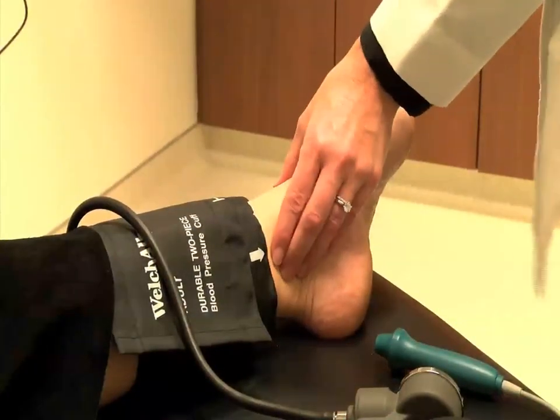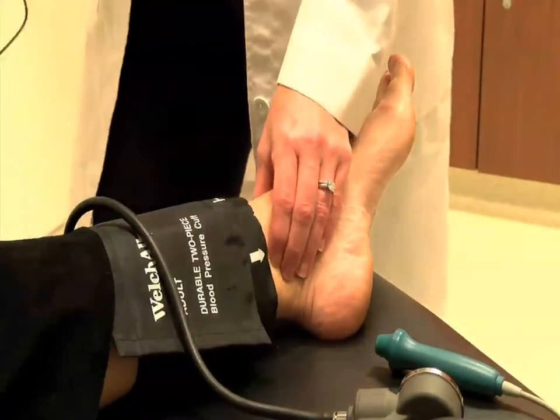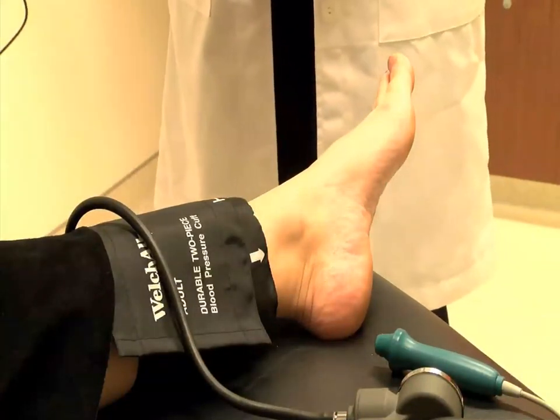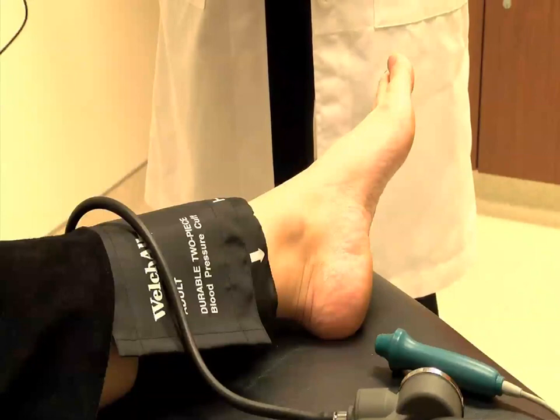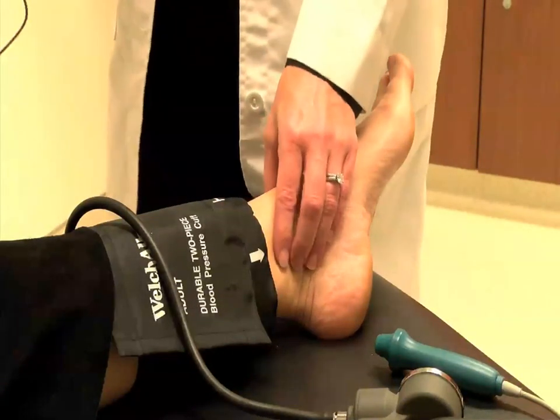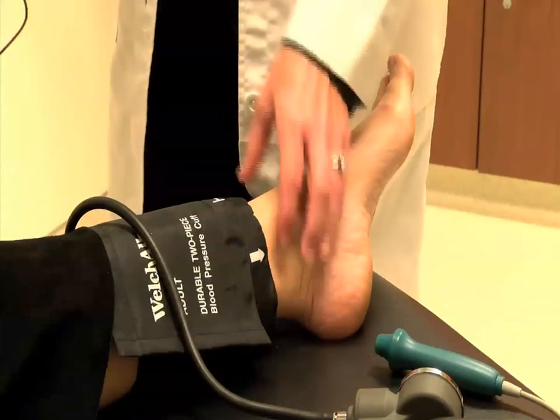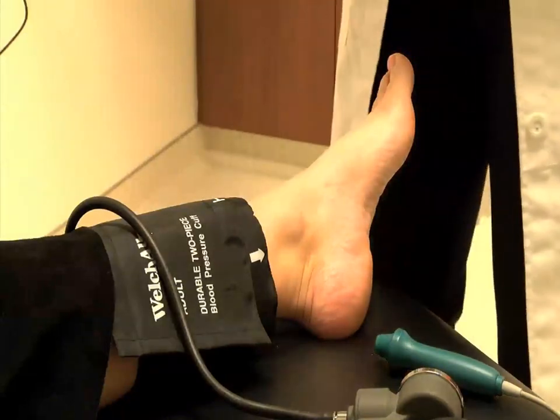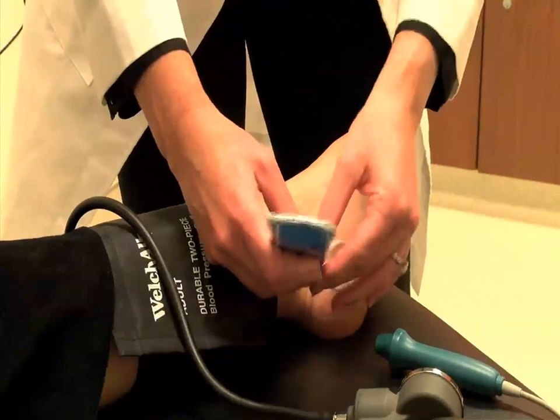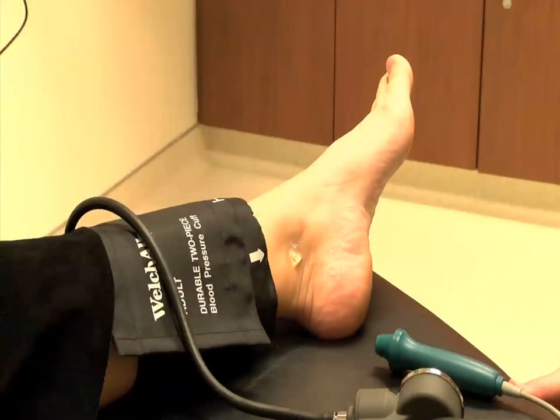Now let's measure our peripheral systolic pulses. The two pulses of interest are the dorsalis pedis pulse, and just posterior to the medial malleolus is the posterior tibial pulse. It may be normal to be unable to feel the dorsalis pedis pulse bilaterally, but you should always be able to palpate a posterior tibial pulse. A non-palpable posterior tibial pulse is always an abnormal finding. With your fingers, locate the dorsalis pedis pulse, and then the posterior tibial pulse is located posterior to the medial malleolus of the foot. Ensure the blood pressure cuff is secured and around and above the ankle.